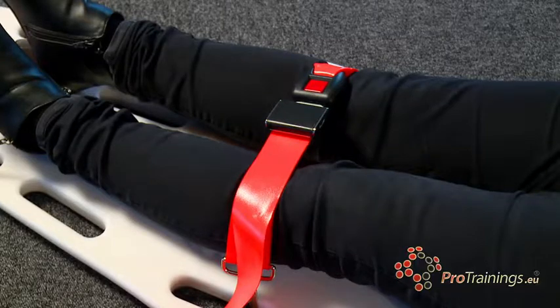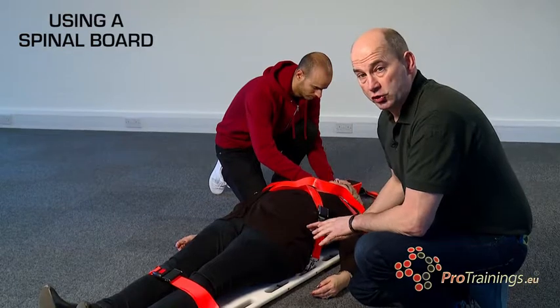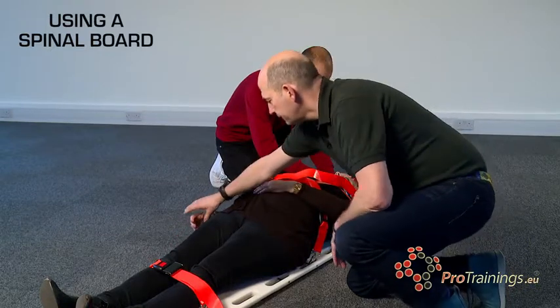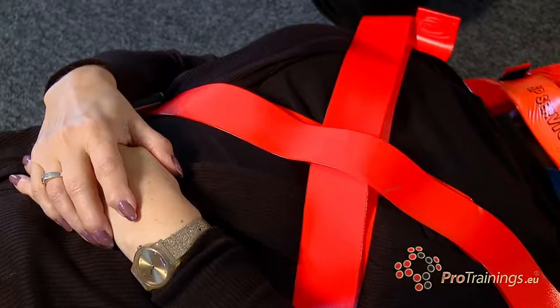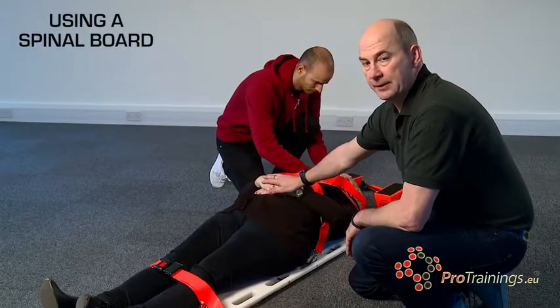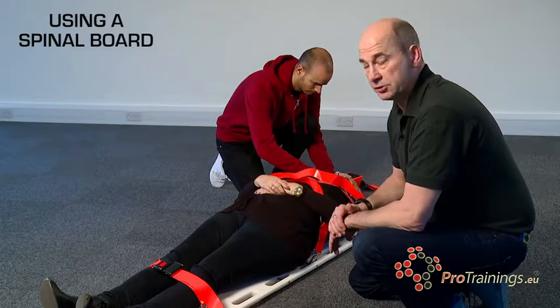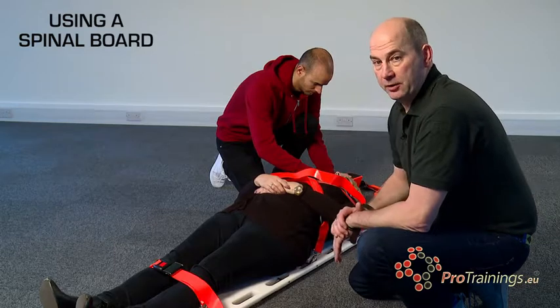Leave the arms out. If the patient is conscious, people don't like having their arms fixed, so get the patient to hold one hand with the opposite hand and keep them out of the way — give them a handbag, purse, or just hold hands together. If the patient is unconscious, it's better to strap the hands in to aid when moving the patient. If they're conscious, they'll hold their own hands.